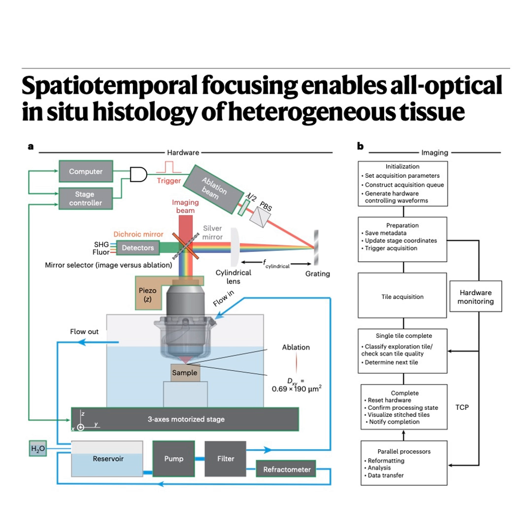And the resolution was maintained throughout that volume. Yes, uniform submicrometer resolution. They quote voxel sizes of 0.35 × 0.35 × 1.0 μm³, so incredibly detailed. What specific biological features could they see with this method that would be difficult or impossible otherwise? You mentioned interface preservation earlier? Right, that was the key demonstration.